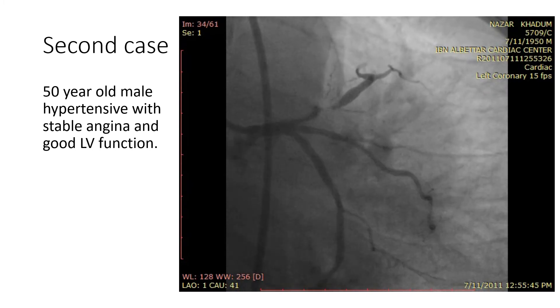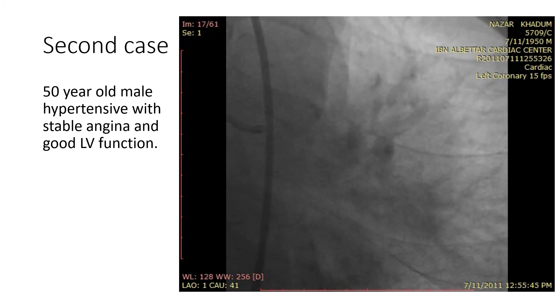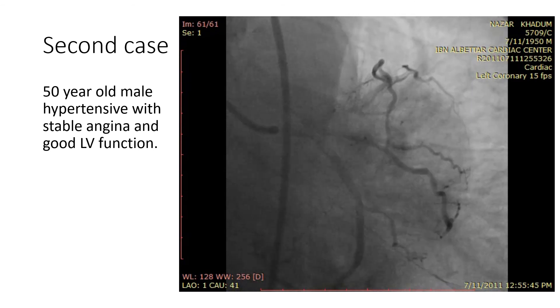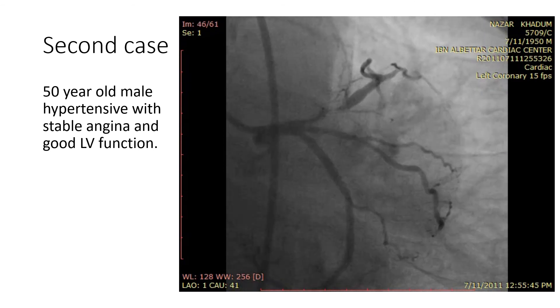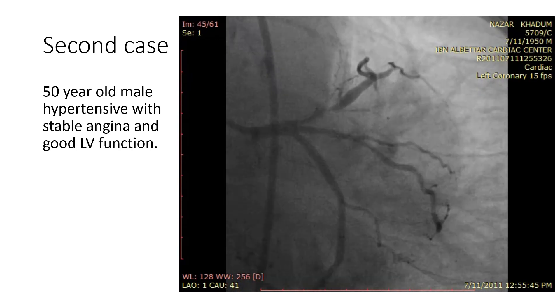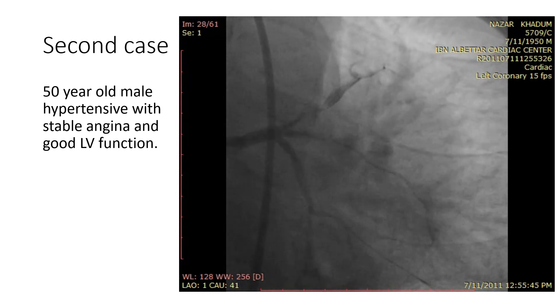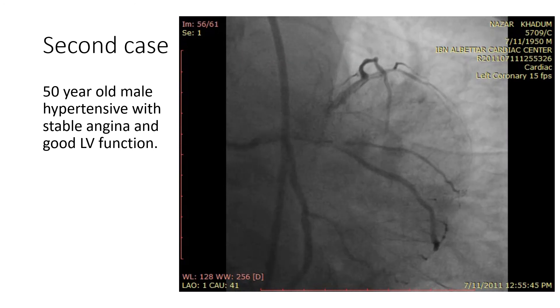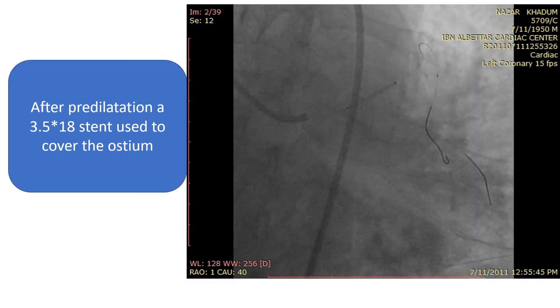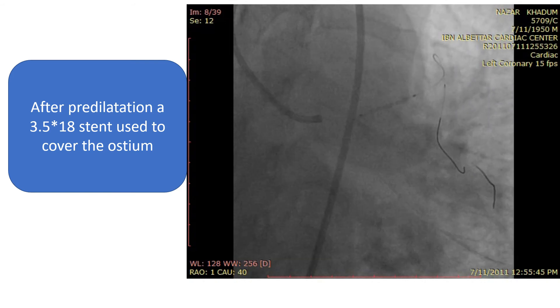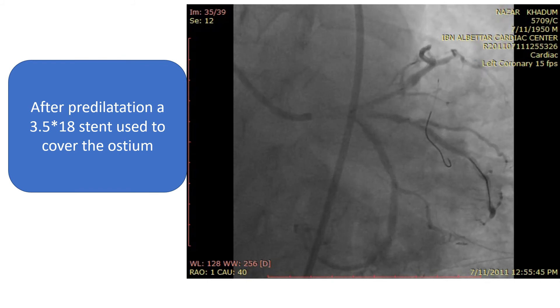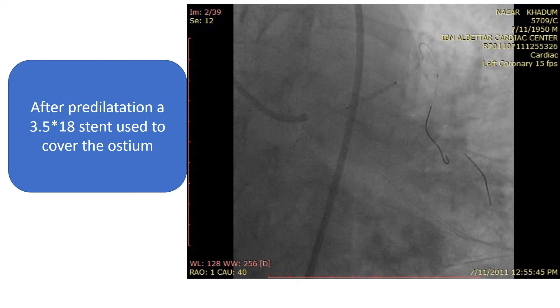The second case is a 50-year-old male, hypertensive, with stable angina and good LV function. This is an apicaudal view of the left coronary system. The left main stem is trifurcate, and there is a critical lesion in the proximal LAD extending to the ostium. The aim was to predilate and stent the LAD with precise localization of the stent at the ostium. After predilatation, a 3.5 by 18 millimeter stent was used to cover the ostium. We can see the stent is moving about 5 millimeters in and out of the left main stem.